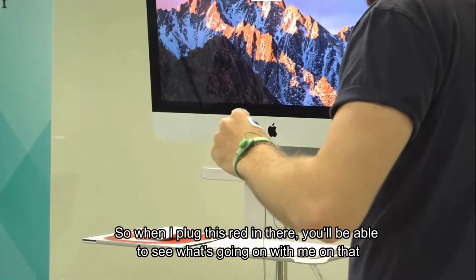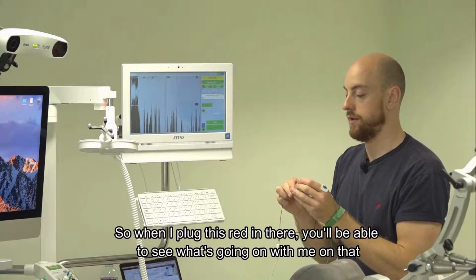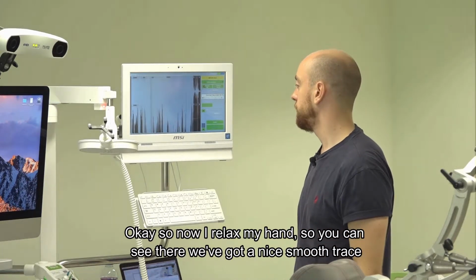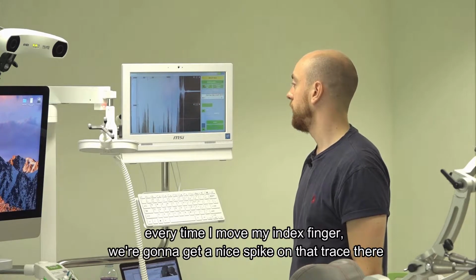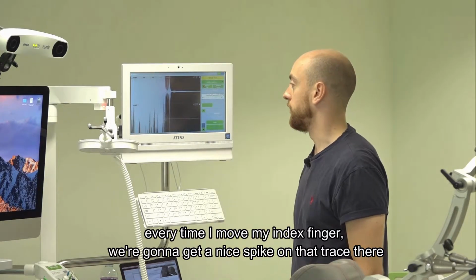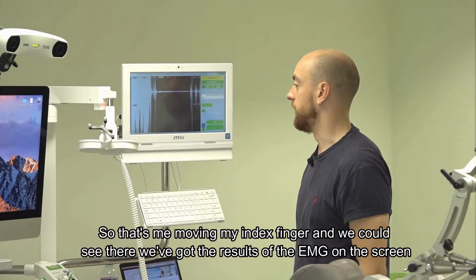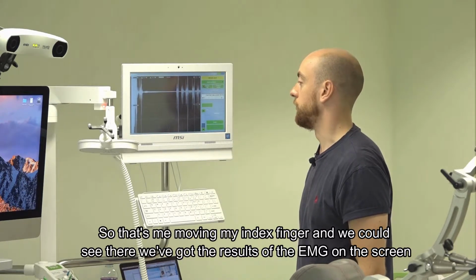So when I plug this red in there, you'll be able to see what's going on with me on there. Okay, so now I relax my hand. You can see there we've got a nice smooth trace. Now every time I move my index finger, we're going to get a nice spike on that trace. So that's me moving my index finger, and we can see the results of the EMG coming up on the screen.